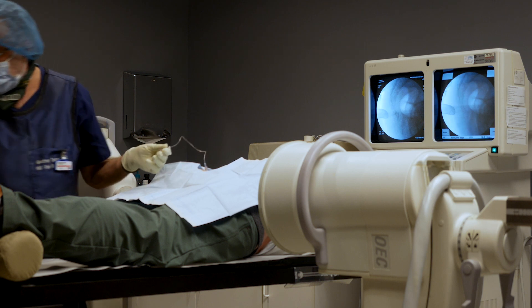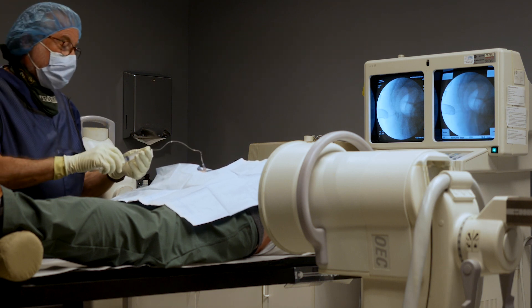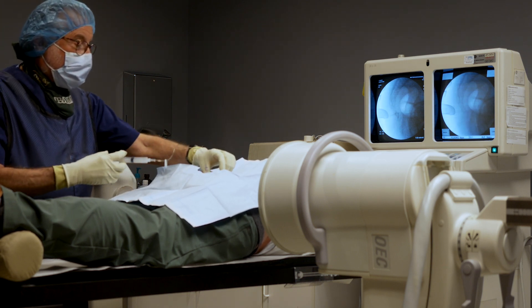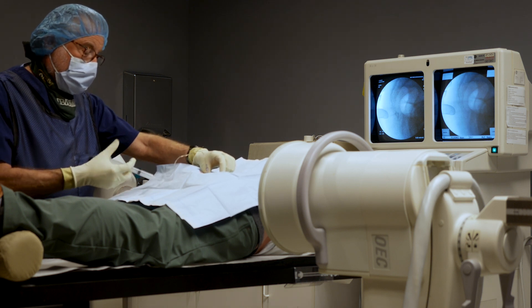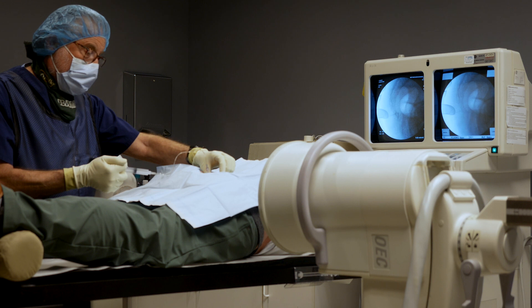We'll put a second one in here — actually, we'll put some steroids here. It's going to ache a bit. Does that feel familiar there where I'm putting the medicine?